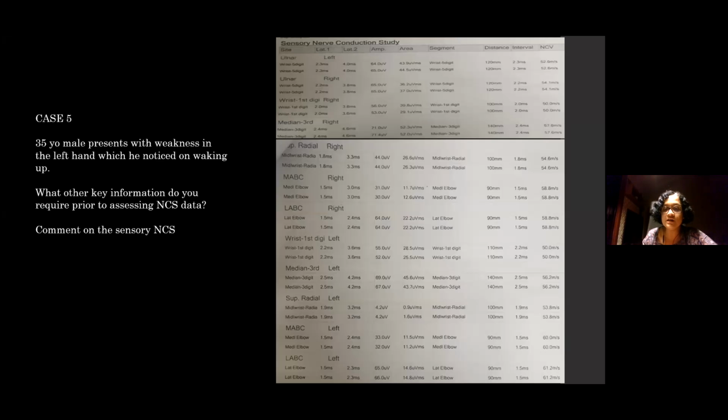Now, nerve conduction studies, so if you can see up here, they all look normal. I don't want to go through each one because it's quite a lot. And one more thing I didn't tell you, the reason I put up these lab-looking, I didn't type everything, all the data out.